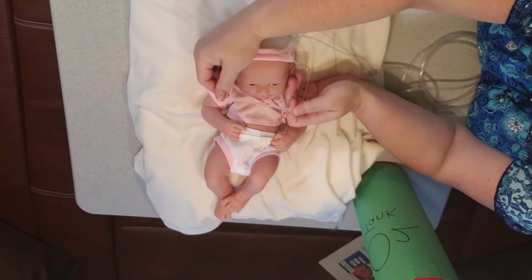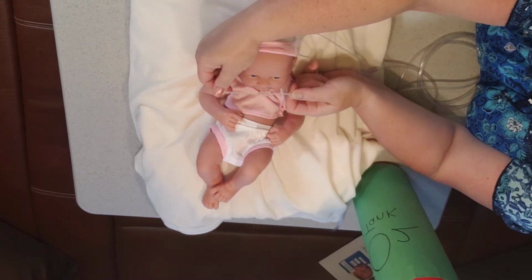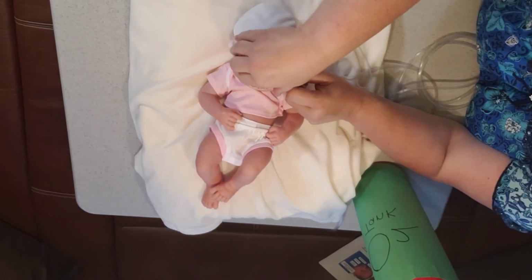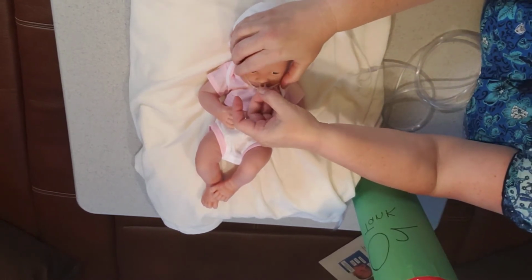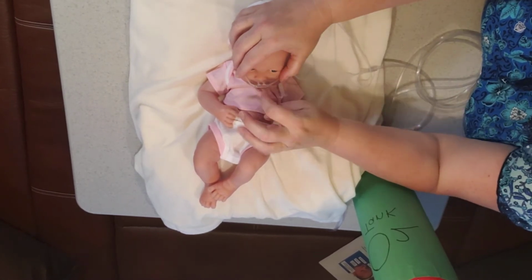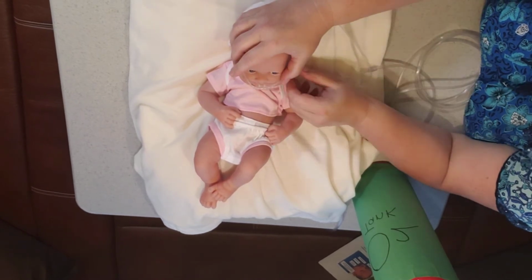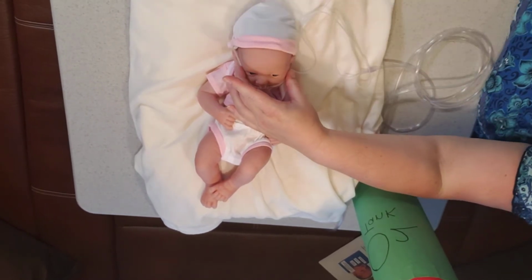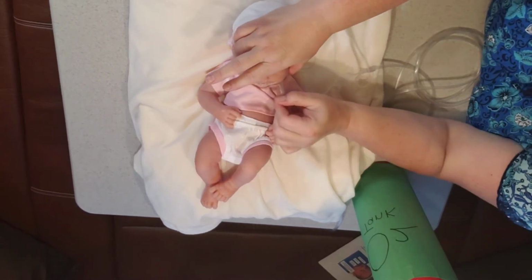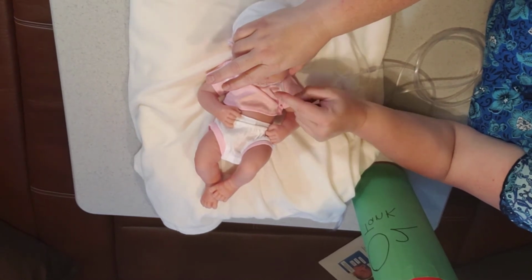So to apply the nasal cannula, the prongs need to be pointed down. You put them inside her nostrils, not too far in, because you don't want the septum of her nose, or the skin between her nostrils, to rub up against this plastic part here, because that can irritate her skin and cause a skin breakdown or damage. And it can hurt her too. Yeah, she'll fuss if that happens. Oh gosh, yeah, that wouldn't be fun.